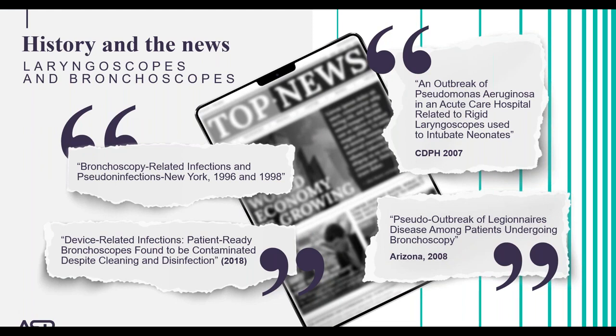In 2007, an outbreak of Pseudomonas aeruginosa occurred in an acute care hospital. This outbreak was related to rigid laryngoscopes used to intubate neonates, which were subjected to cleaning but no further reprocessing. The laryngoscopes were originally being reprocessed in sterile processing, but they were getting lost. So respiratory decided they wanted to take back over the practice, but they were just wiping them down with alcohol. The sentinel event actually shut down the neonatal ICU for this facility, and unfortunately, a couple of babies died.